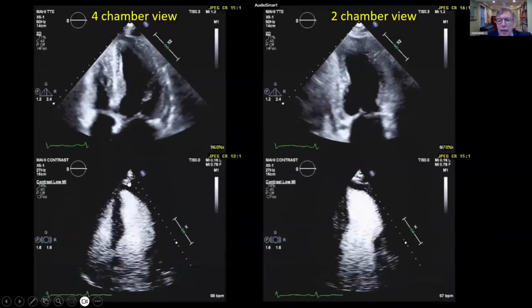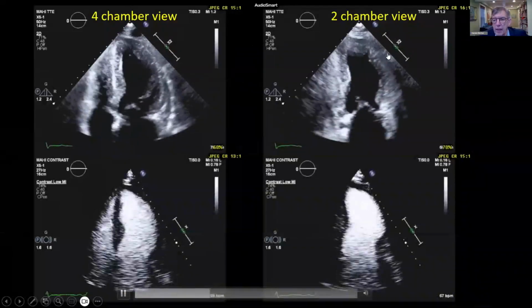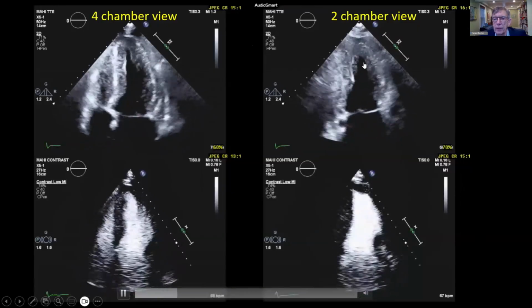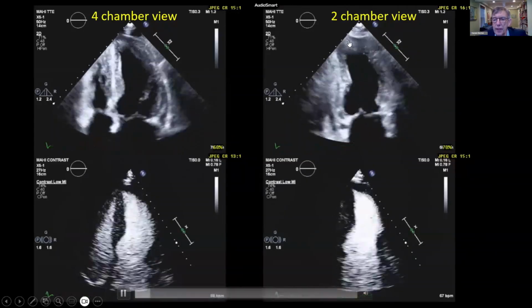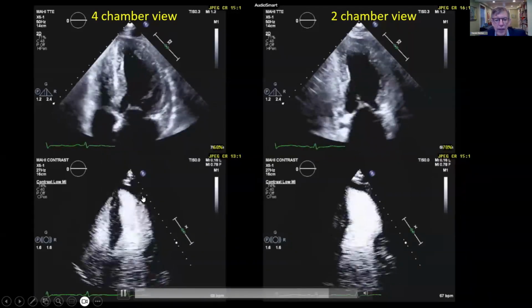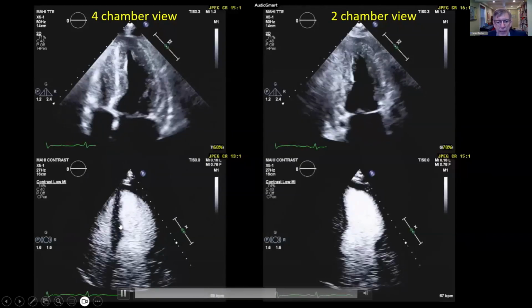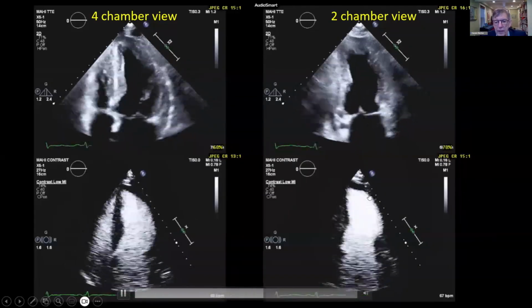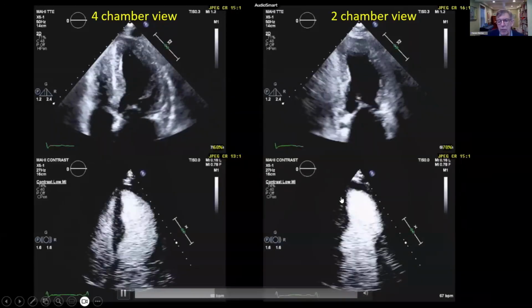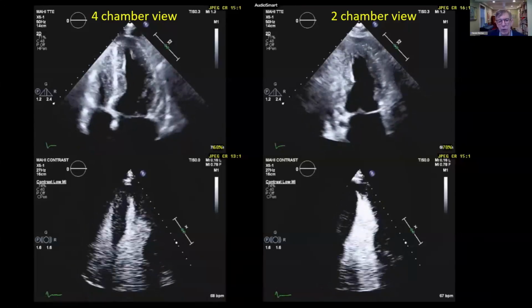But look at that, the patient now we show you here, the systolic movement of the 2-chamber view. And in diastole, it's very difficult to delineate the border. And you see how much easier it is when you have the blood pool enhanced and clearly see the border. And that helps you to assess regional wall motion abnormalities or just to classify wall motion as normal.